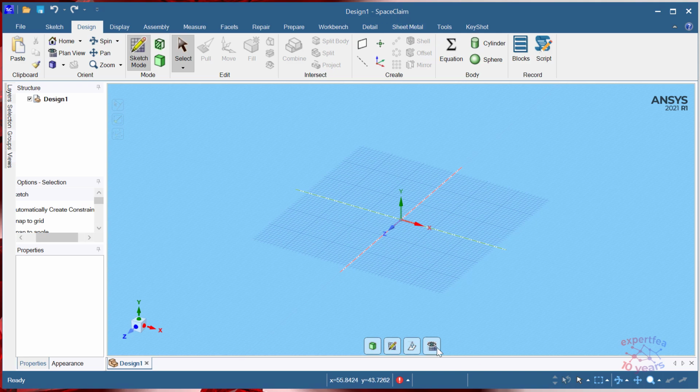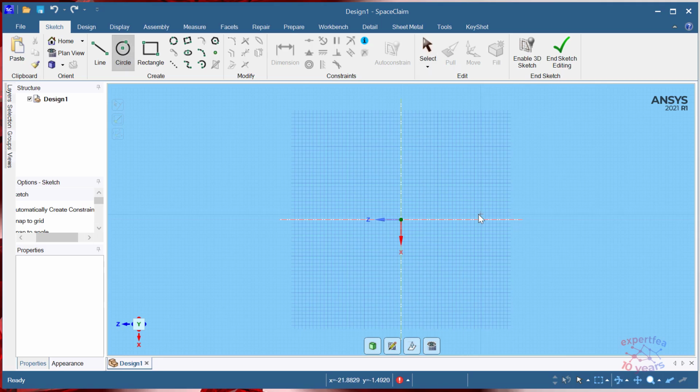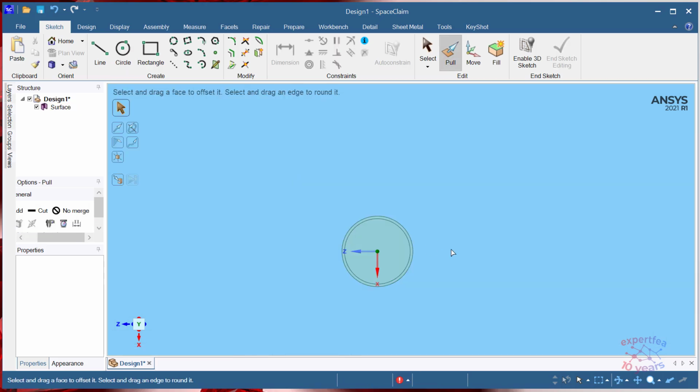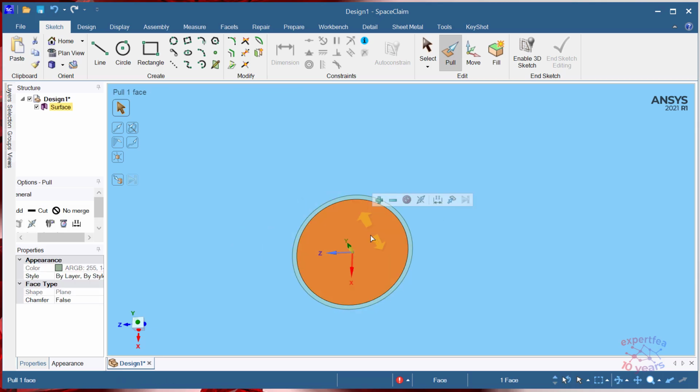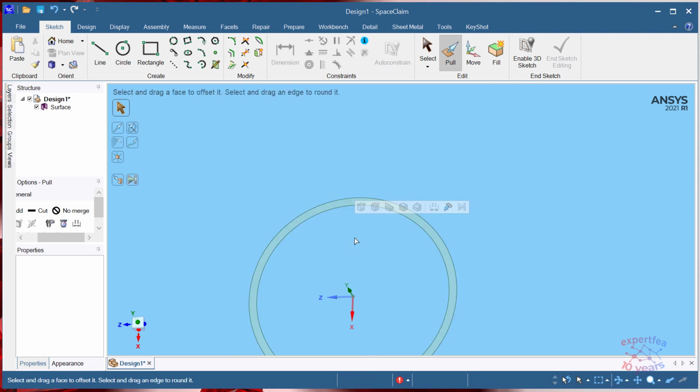I open SpaceClaim. Here I will go to the plan view and just go to the sketch tab. Draw a circle of 5 mm, and the maximum thickness I would like to be maybe 0.2. This means 5.4 here. Let's go to 3D. We don't need this internal surface, but you can see here we have this outer surface. If I click this edge and this edge, we can see that the thickness is 0.2.